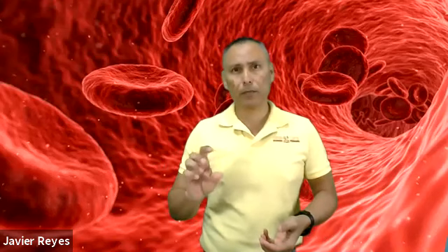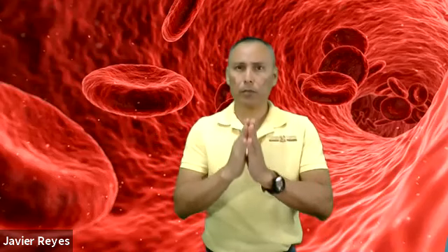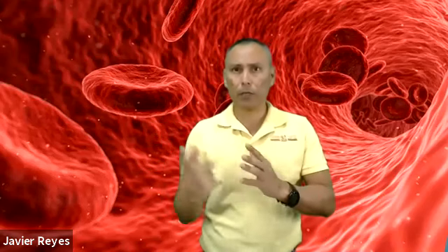Okay, when you get your specimen and you do it too hard or you shake it like that, you are actually destroying the red blood cells. Those red blood cells will spill into the serum and the plasma when they are centrifuged, and we call that a hemolyzed specimen, and it's going to be rejected. That's probably the biggest reason why specimens get rejected, because of hemolysis. Okay, so hemoglobin escapes into the fluid part of the specimen, which is your serum or your plasma, and therefore yields a hemolyzed specimen that will be rejected.